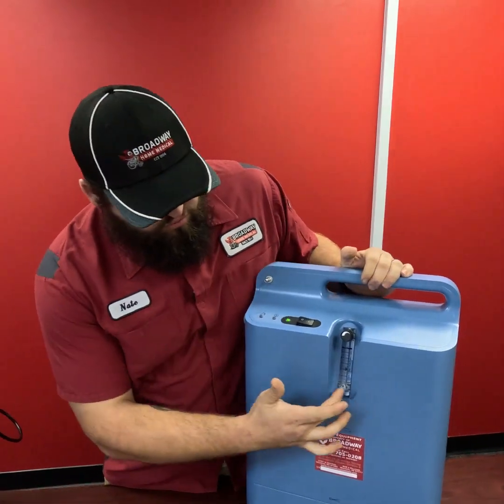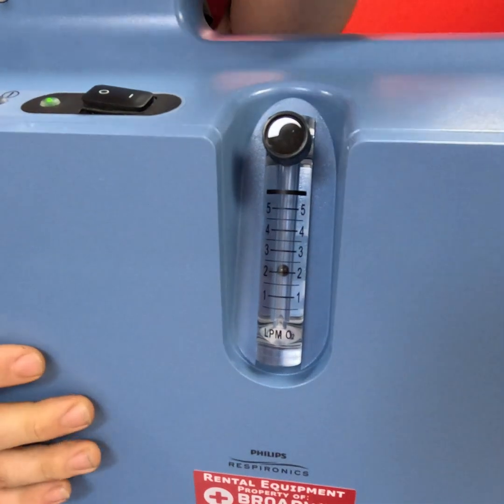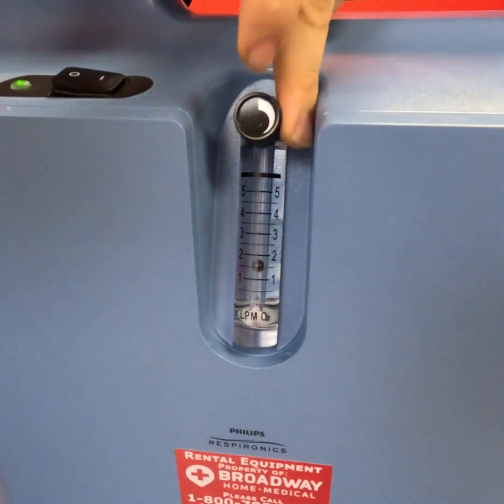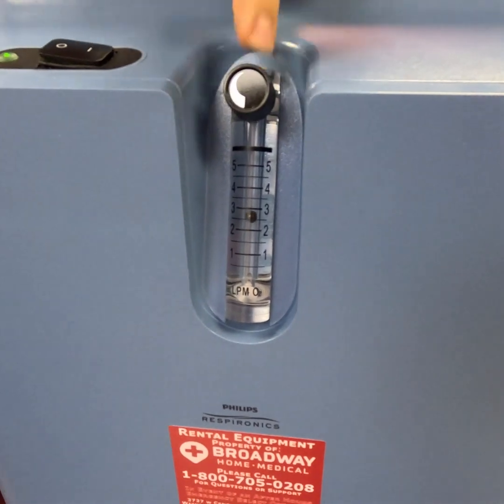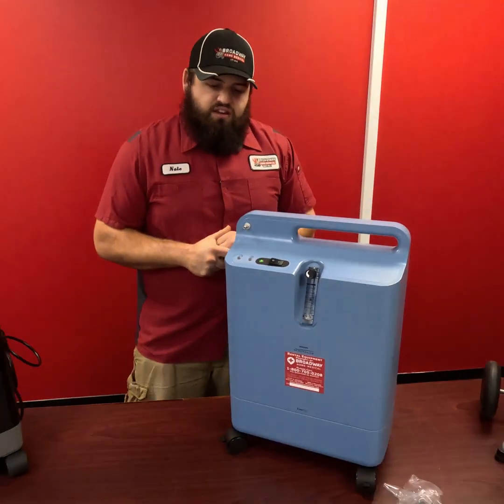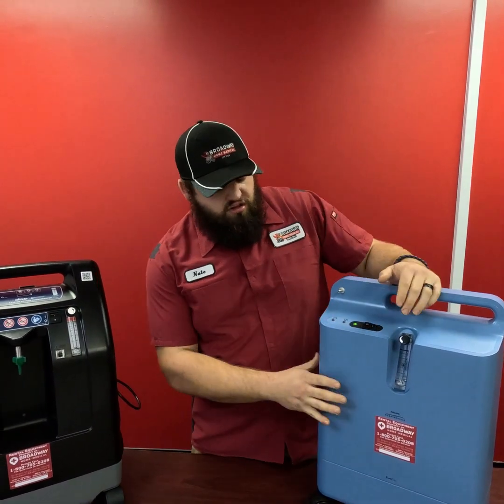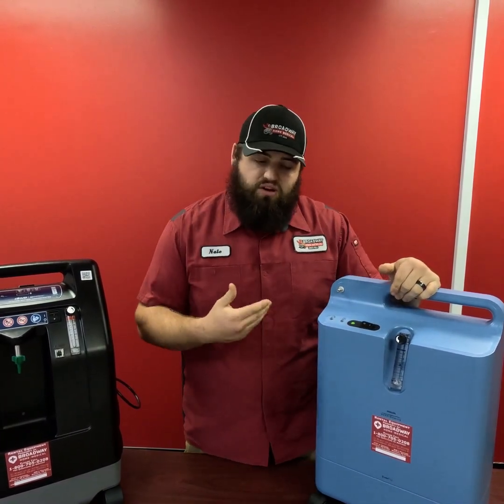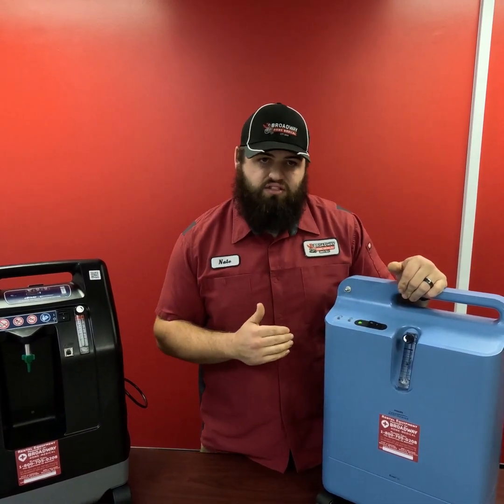Now, like I said before, we have our flow meter here in the middle. This flow meter has a little ball that jumps up and down in there, and this is what sets the liter flow of oxygen. Now your liter flow is prescribed to you by a doctor, so we always want to go based off of whatever your physician prescribes to you, and we'll always set up based on that.